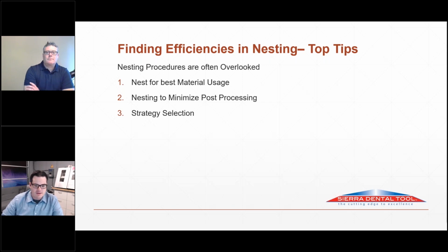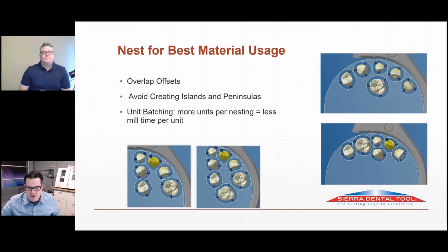So, Nick, why don't we talk a little bit about material usage here? Yeah. So I walk into a lab. I'm probably going to say this a ton of times because I do walk into a lot of labs, and I'll walk over to the CAM software, because that was a niche that I really enjoyed getting into. I spent a lot of time designing, but milling and nesting was always overlooked when I went to a lot of these labs.